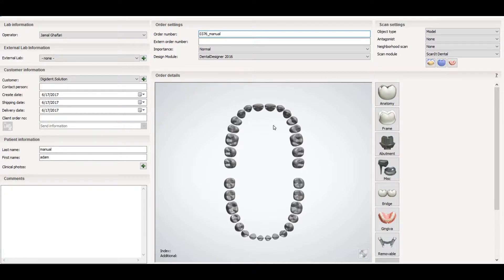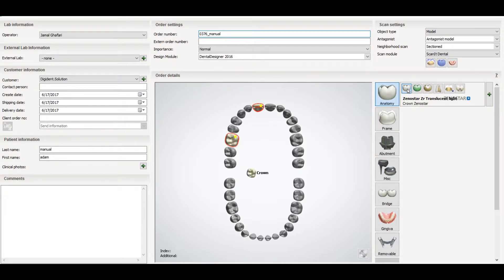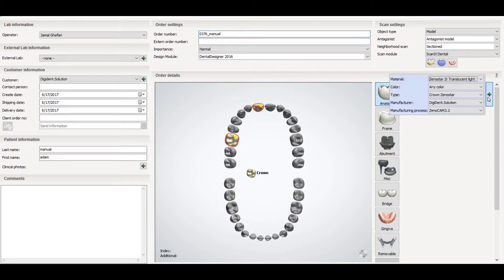First, let's talk about a simple full anatomical crown — anterior or posterior. If you want to make anterior or posterior, we will select the relevant tooth. Then we go to the anatomy first option and select the crown. We will select this one, then the plus sign.